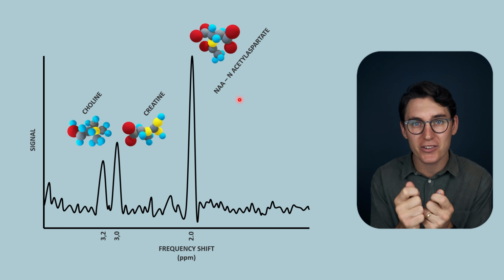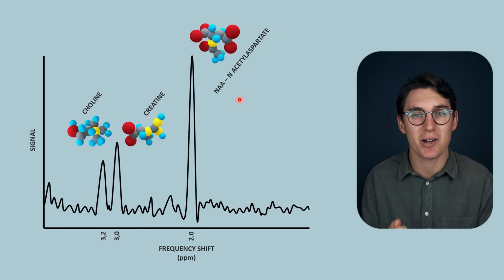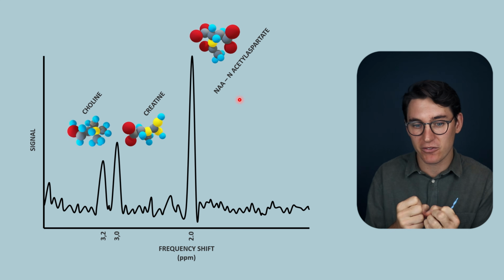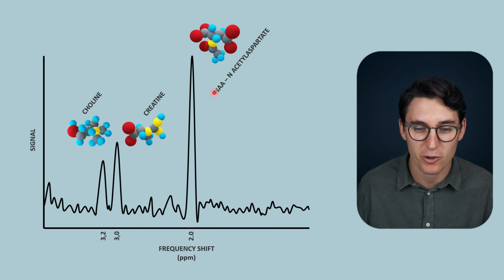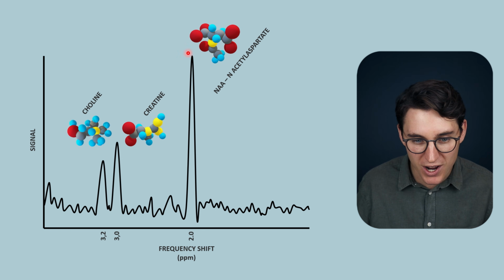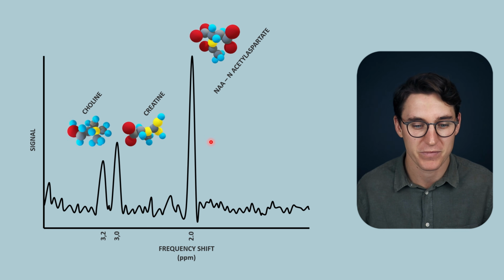That corresponds to healthy neuronal tissue. If we've got any form of disease process that decreases the number of healthy neurons, say we've had a stroke, or say we've got MS plaques, or say we've got a metastasis that's not made up of neurons, we will get a decrease in signal in that location coming from the NAA, or N-acetyl aspartate metabolite. And signal roughly corresponds to the concentration of the metabolite within that region.